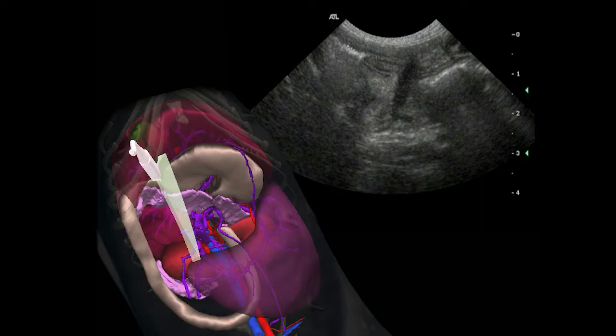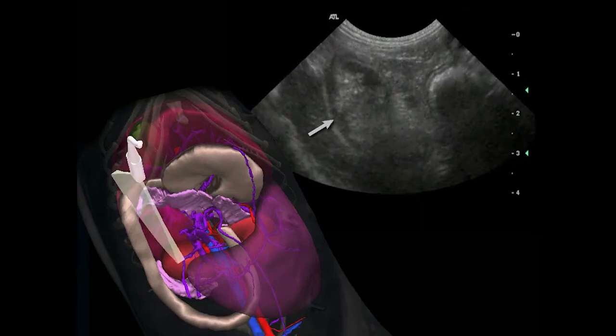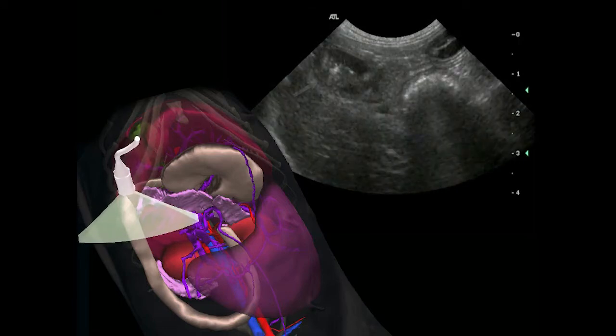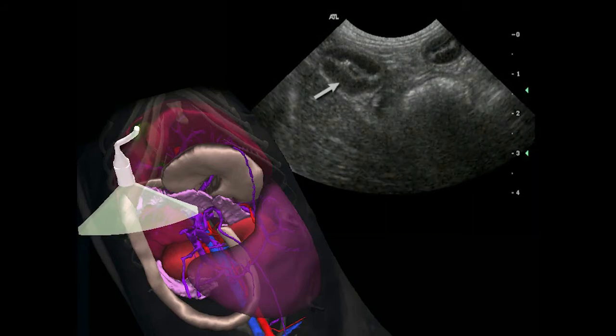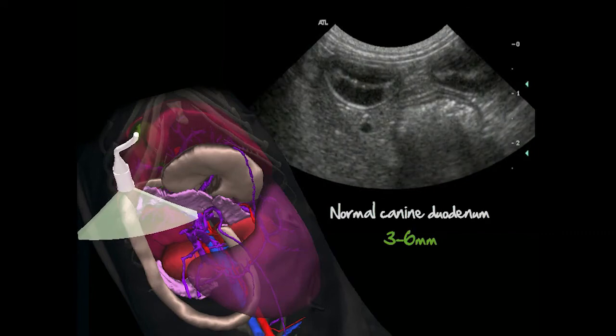Placing the probe under the costal arch or between the last two ribs and pressing slightly when needed, the duodenum is followed in transverse plane along the cranial flexure, turning the probe slightly as you move along. The entire length of the descending segment must be examined. Note the prominence of the duodenal mucosa in dogs. This segment has the thickest wall of the GI tract in this species.